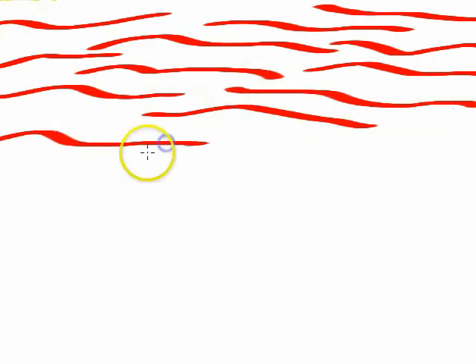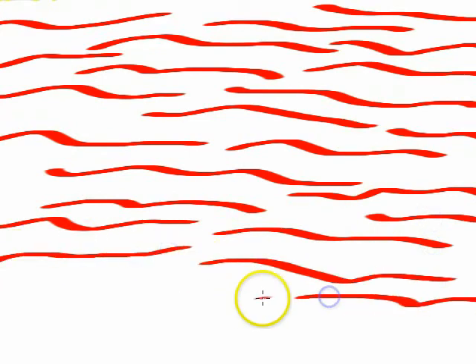Smooth muscle is found in sheets, where the skinny individual smooth muscle cells are stacked on top of each other. Each individual cell is tapered at the ends and thicker in the middle, where the nucleus is found. It's similar to a stretched out ravioli in appearance. The cells are arranged in a staggered pattern, similar to the arrangement of bricks in a wall.